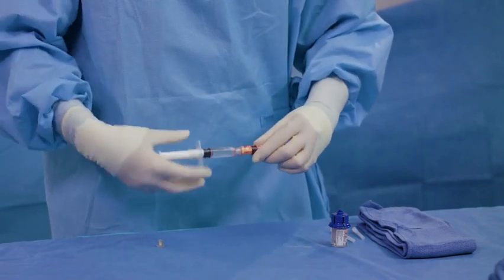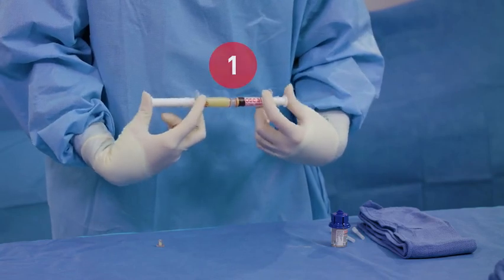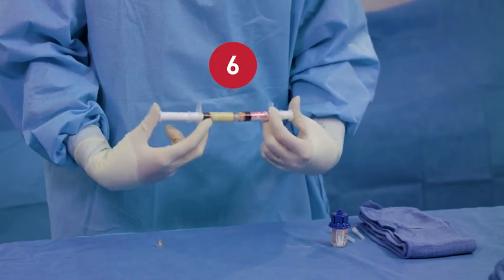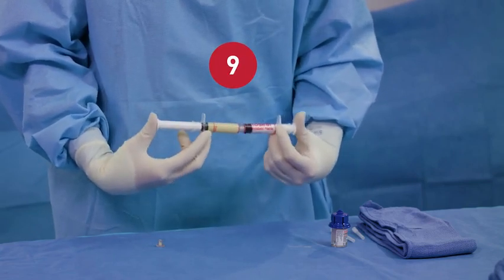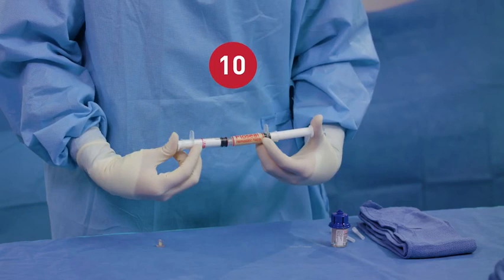Connect the thrombin syringe to the gelatin syringe. Quickly and firmly push the thrombin solution into the FlowSeal gelatin matrix. Transfer the mixture between syringes for a total of 10 back and forth passes. Push the FlowSeal matrix into the syringe labeled FlowSeal and keep the syringes connected until ready to use.